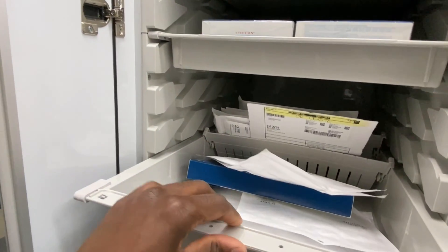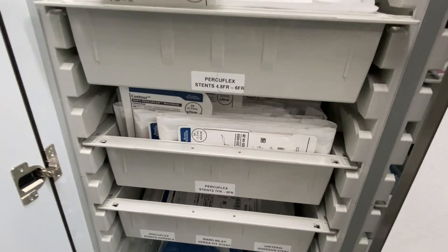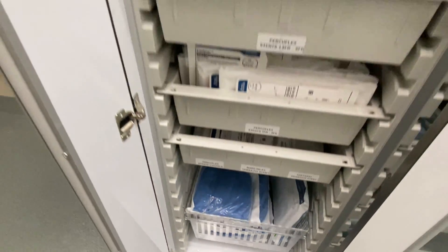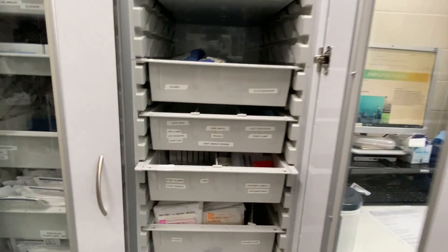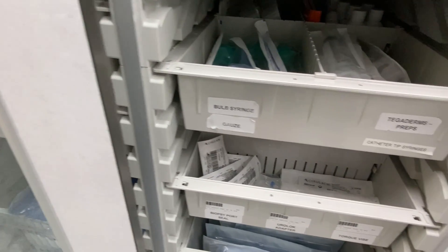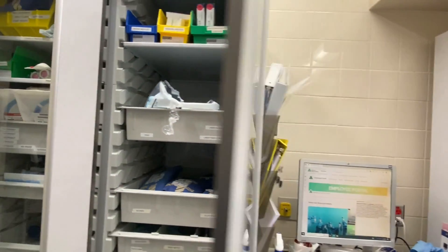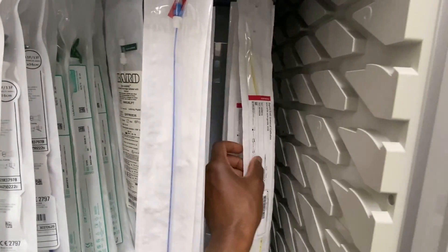Here we have some stents — looks like some ureteral stents. Showing you a little bit extra: we've got some gloves, specimen cups, bulb syringes, gauze, catheter tip syringes. Nothing too crazy — cysto's not too bad honestly. Here's that open-ended catheter I was telling you about, 5 French.